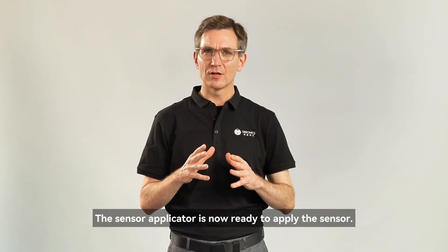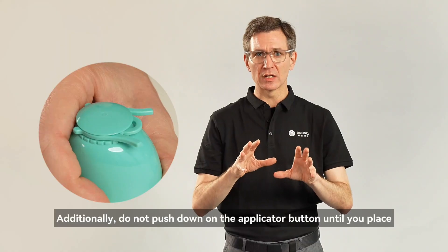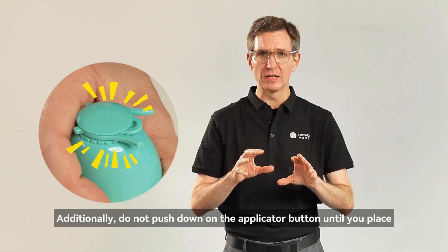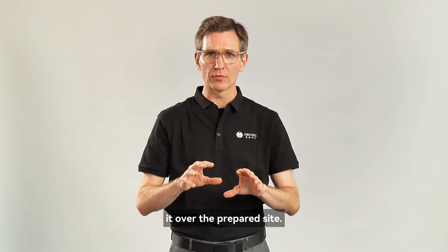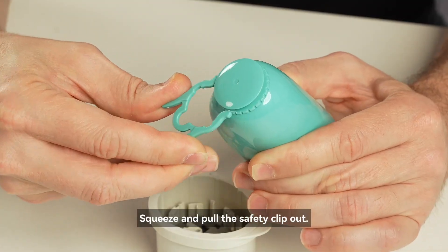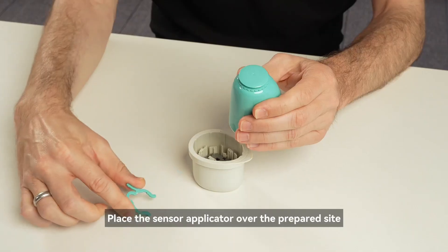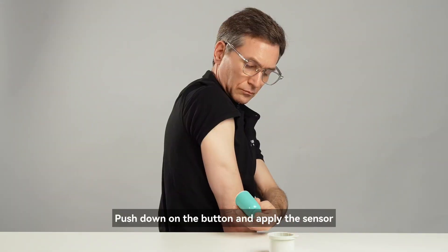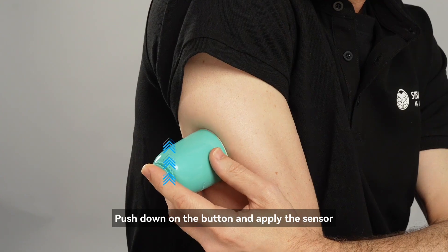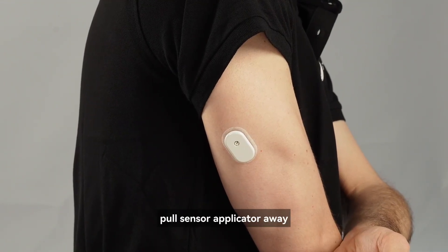The sensor applicator is now ready to apply the sensor. Do not push down on the applicator button until you place it over the prepared site. Squeeze and pull the safety clip out. Place the sensor applicator over the prepared site. Push down on the button and apply the sensor. After you hear the click sound, pull the applicator away.